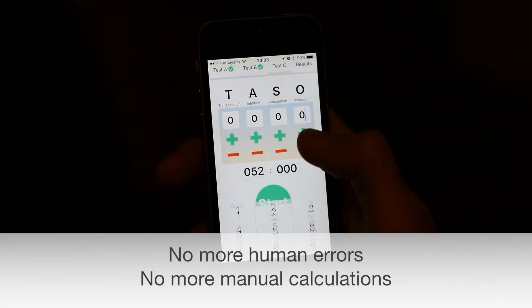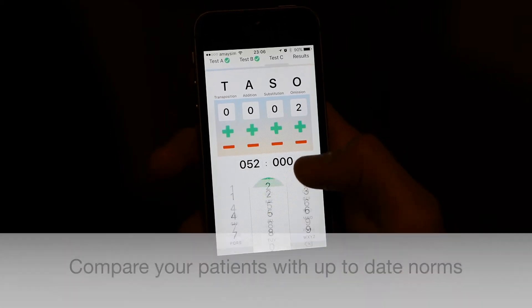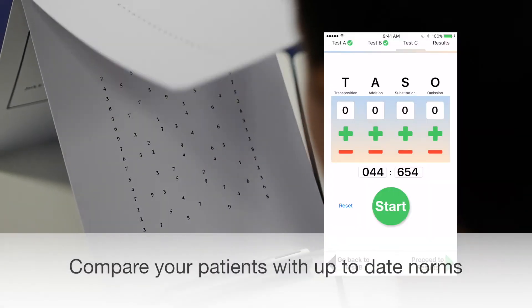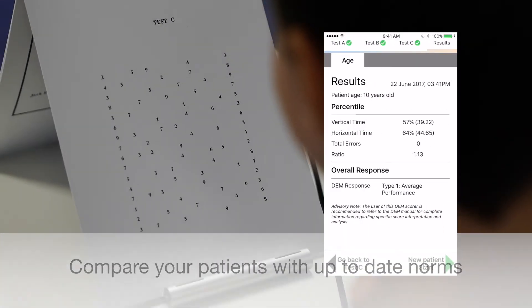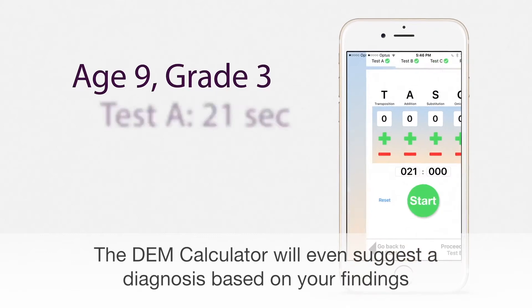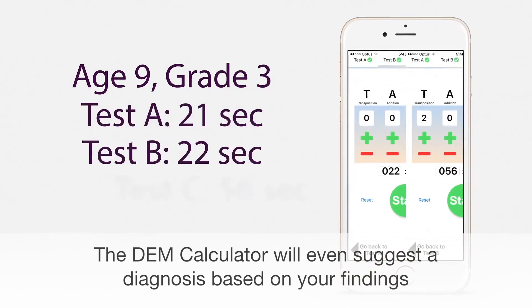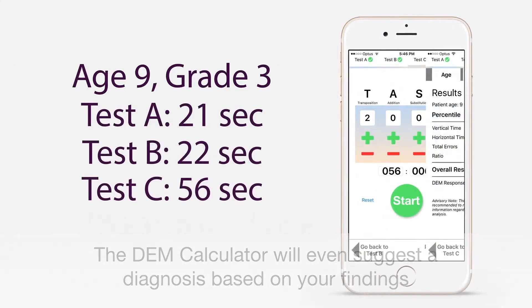No more human errors. No more manual calculations. Compare your patients with up-to-date norms. The DEM Calculator will even suggest a diagnosis based on your findings.